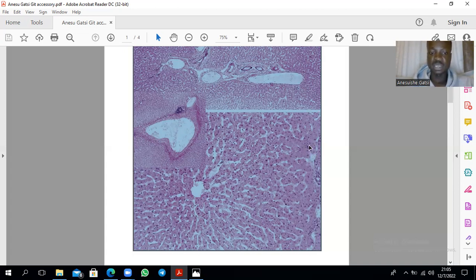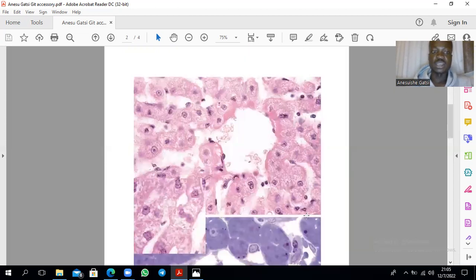This specifically, this is a bile duct. That's a bile duct. That's another bile duct. Remember, I said bile will actually flow in a centrifugal manner from the center towards the periphery, right? Then, if you look at it at an even higher magnification, that's a central vein.